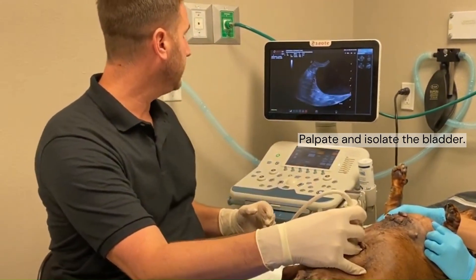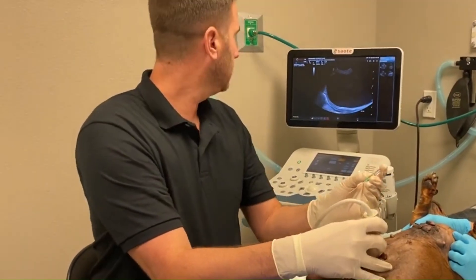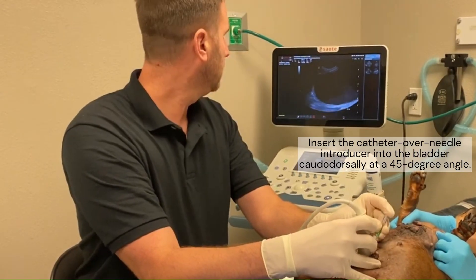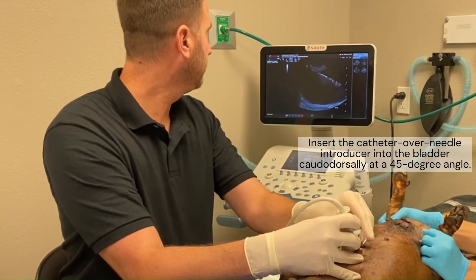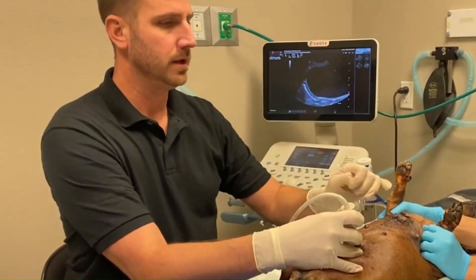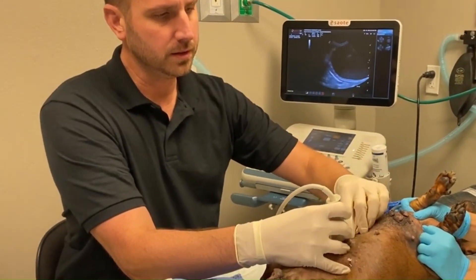What I'm going to do is come all the way up here to the apex of the bladder, and you want to take your over-the-needle guide catheter and place that at a 45-degree angle into the bladder. Go ahead and go all the way in, and then we're going to remove the needle and take our guide. A little tip here is that you actually push down on the hub itself.